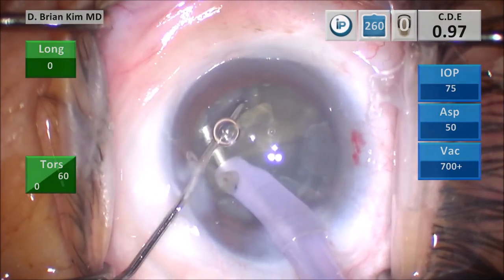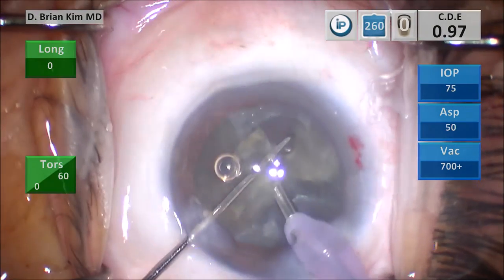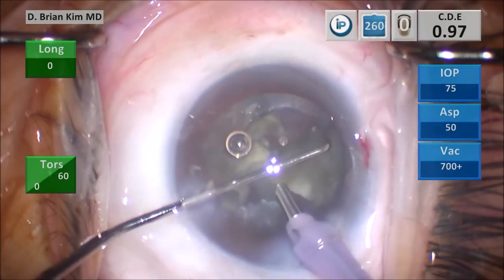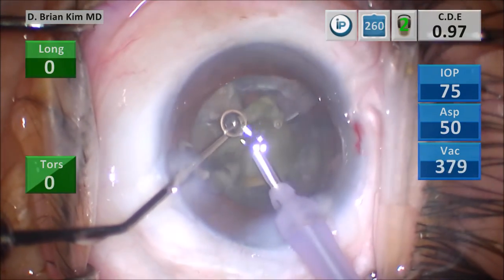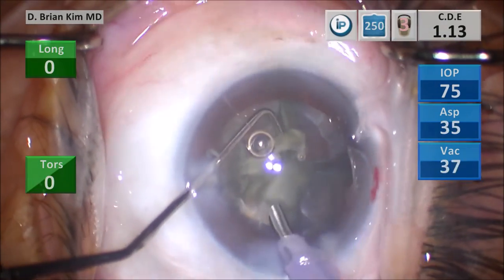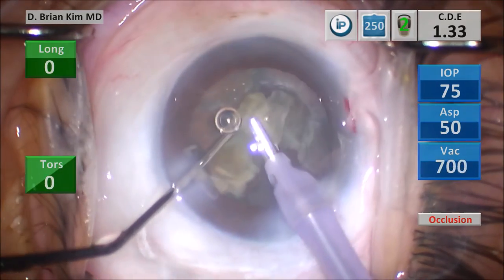To make that clear: I am not placing the phaco tip extremely deep in the bag, just deep enough that it's going to bisect that lens when the chopper is pulled towards the phaco tip. You can see the third and fourth quadrants are divided now. I'm doing some lateral separation to make sure they are completely bisected. I'm using vacuum to manipulate the lens piece and then crushing it between the chopper and the phaco tip, using bursts of ultrasonic energy as needed but primarily high vacuum and mechanical fracturing forces to crush them into smaller pieces.